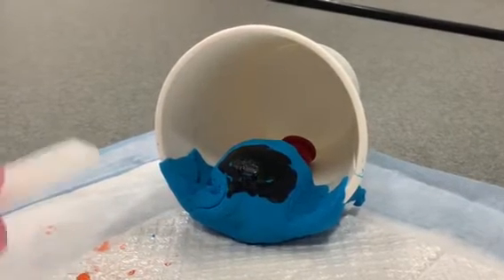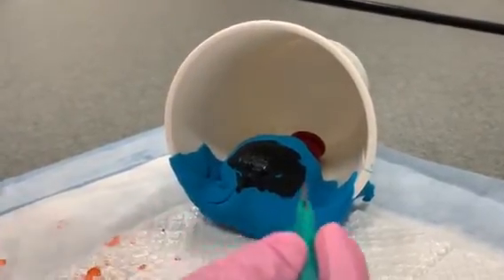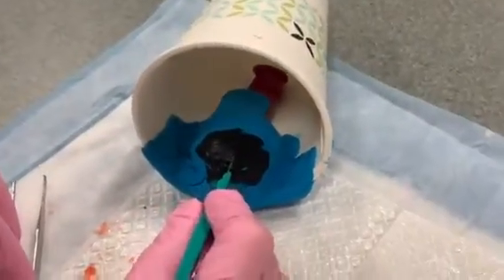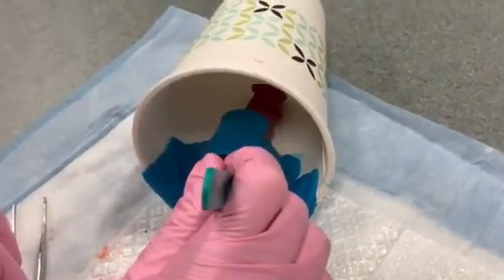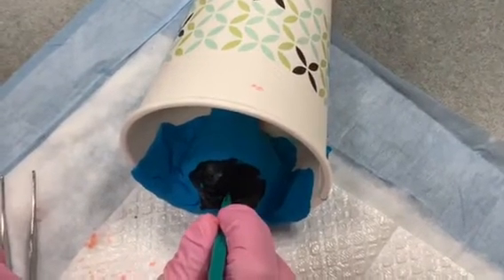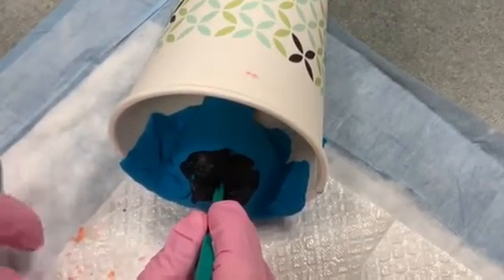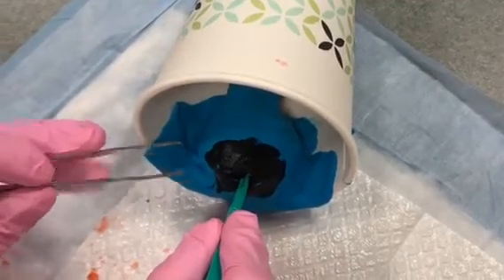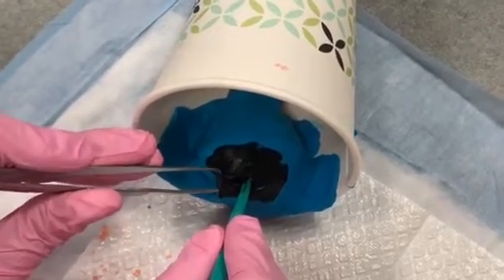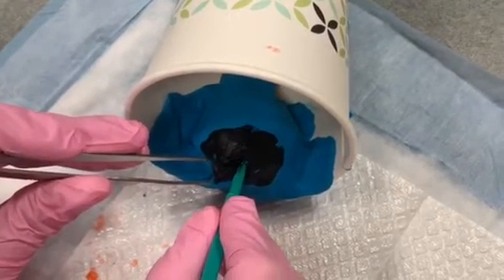Now I'm going to make an incision right where I applied the anesthesia, using a number 11 blade. The incision is going to be 5 mm to 1 cm long. This is different from an incision and drainage, which will typically need an incision of 1 to 2 cm. You don't want the incision to be too big, otherwise the Word catheter will just fall out.